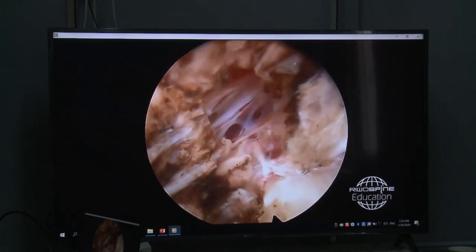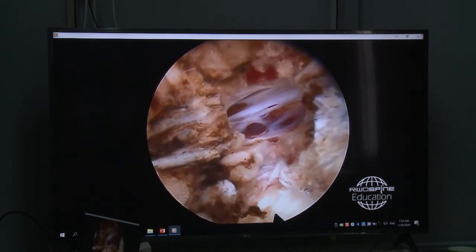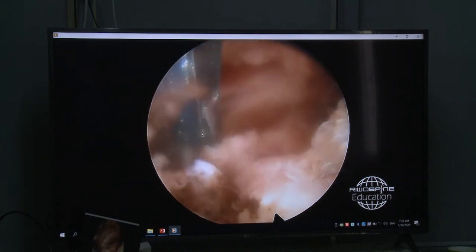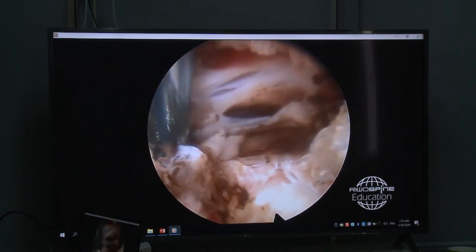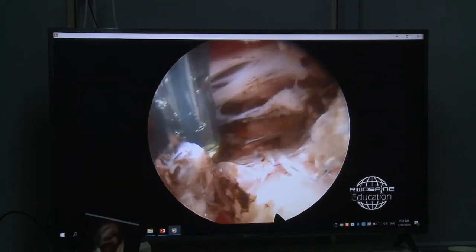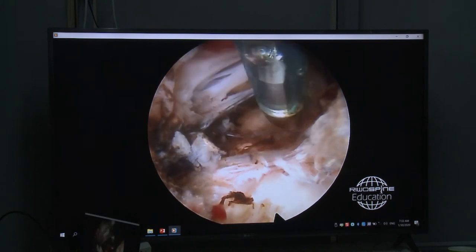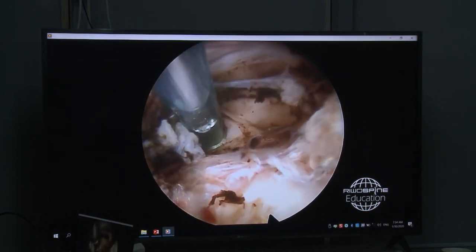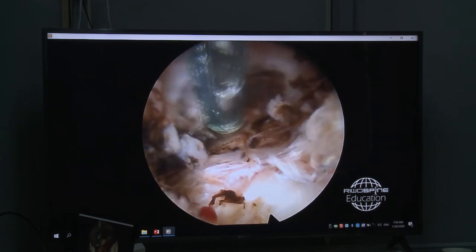Now we cut the PLL to go to the herniation. You see something there, the white one. It's herniation. What is the root? Which root? Traversing? Yeah, what is the root? You will see that.